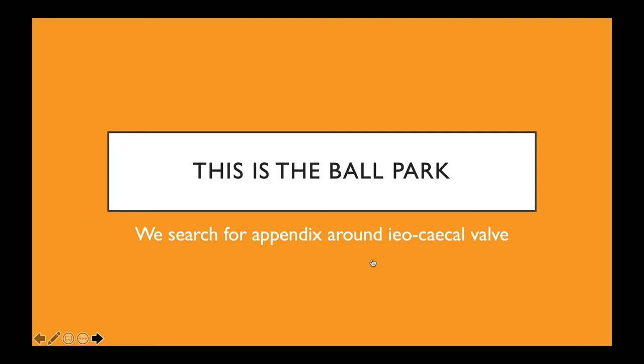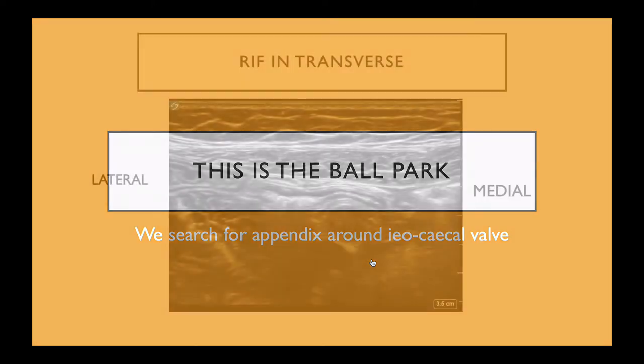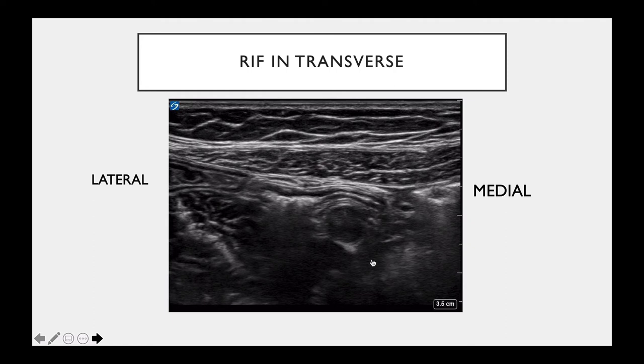We found the ileum and we found the cecum. At this point, I would often swap over to a linear probe. This is if we have a small patient. If you have a large patient, you may have to stay with the curvilinear, and you will probably see an abnormal appendix, but you won't necessarily see a normal one. I do love the linear probe, particularly if you can find the virtual convex setting.